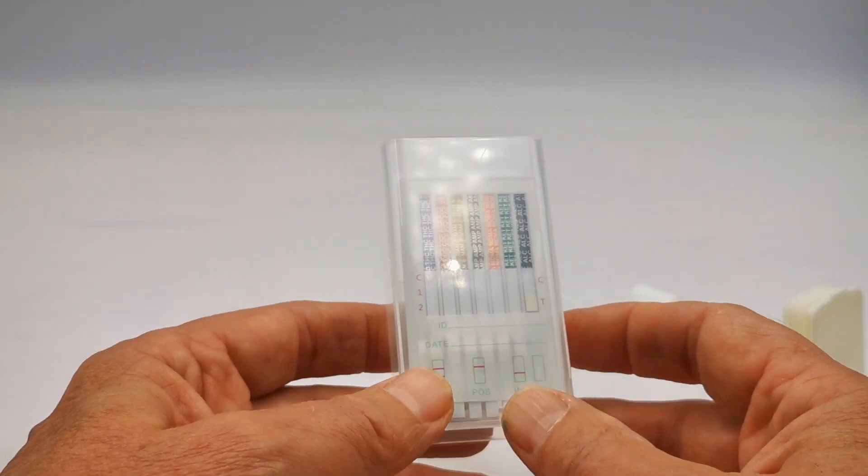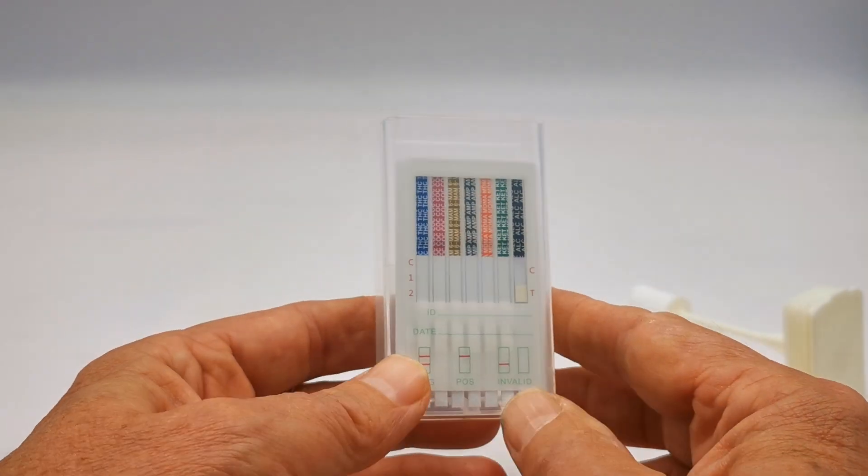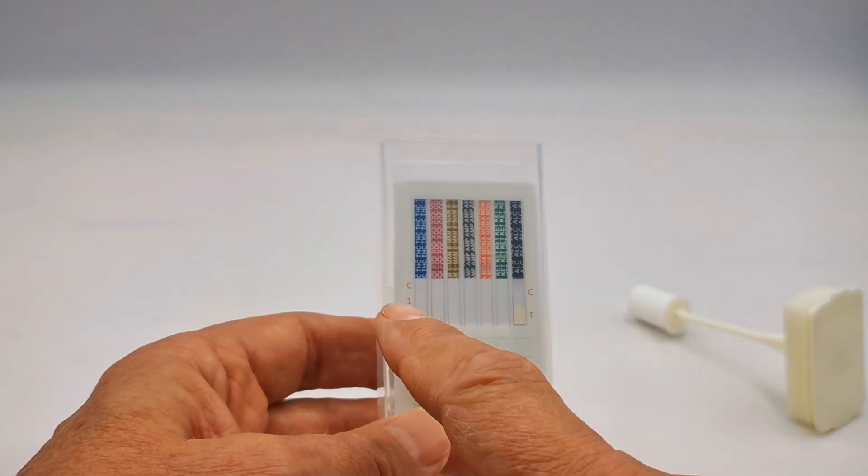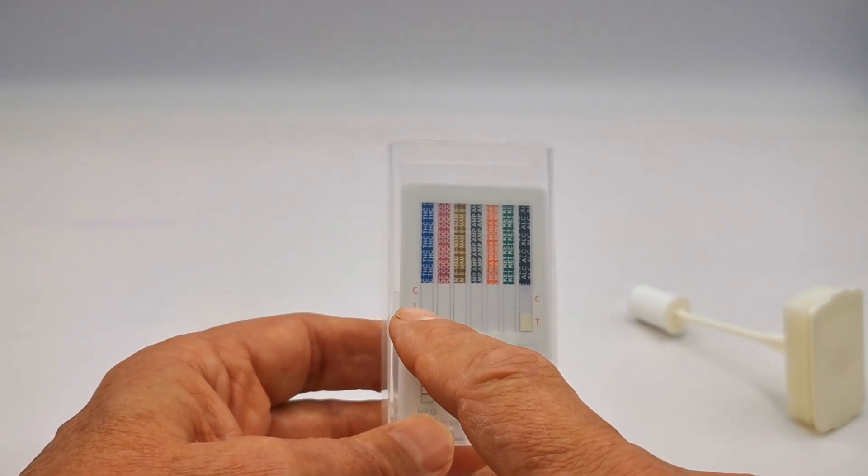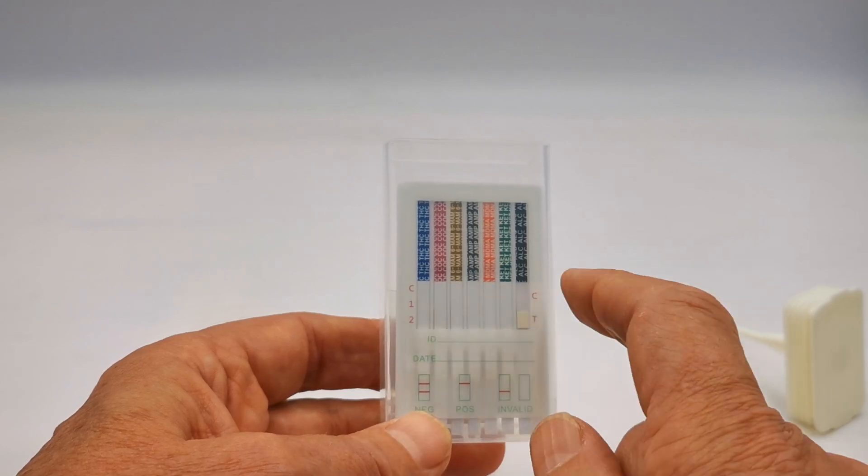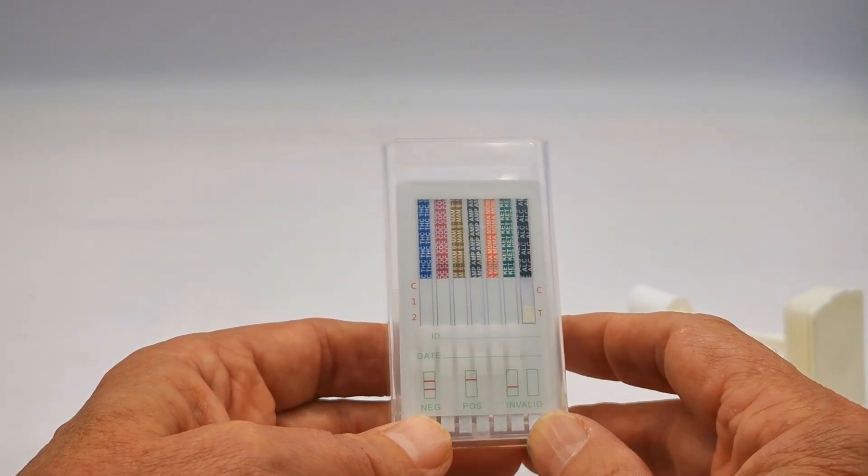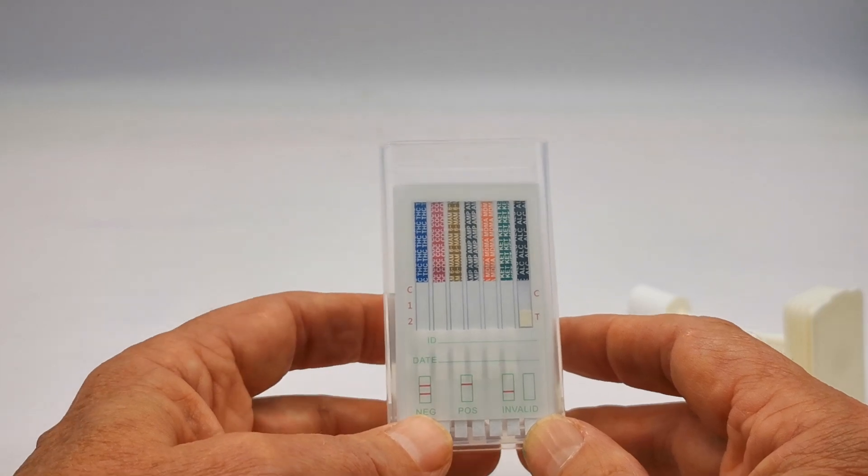This is the test cube ready to go. You get it out of the foil just before you're ready to do the test. You'll see marked on the front are indicative areas for the control lines and one and two where you may have a combination of control lines and test lines.